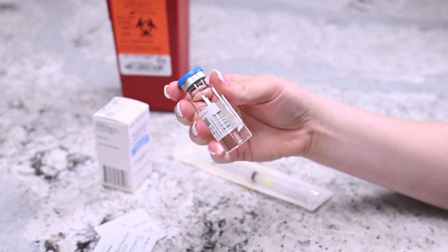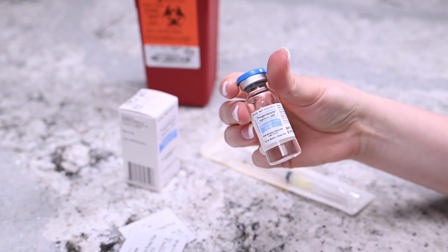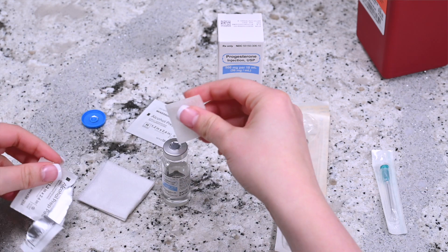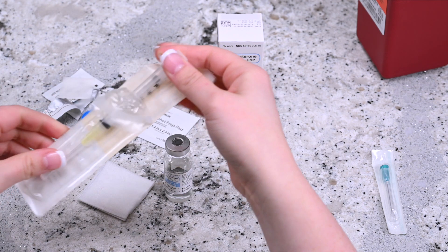Make sure that the vial of progesterone in oil does not contain free-floating particles. Remove the cap from the vial of progesterone in oil and wipe the top of the vial with an alcohol prep wipe.